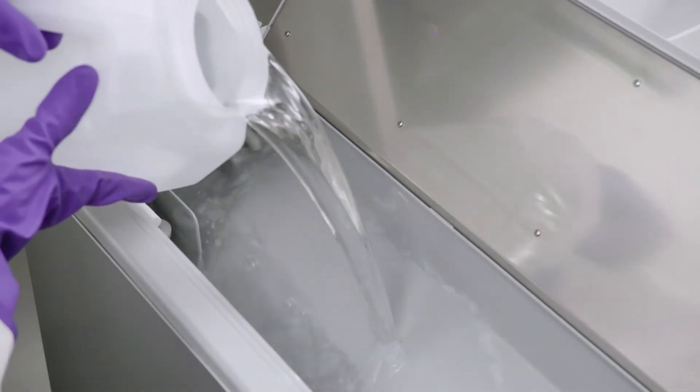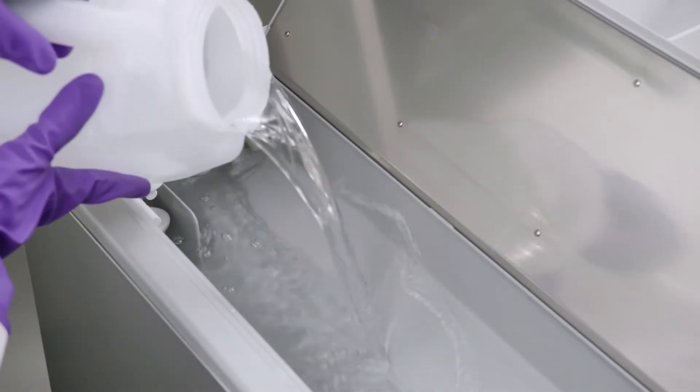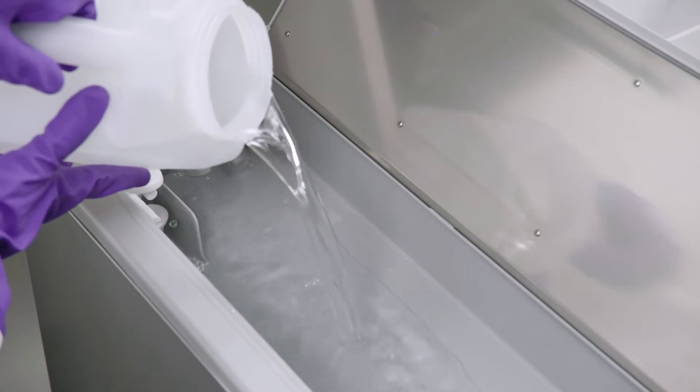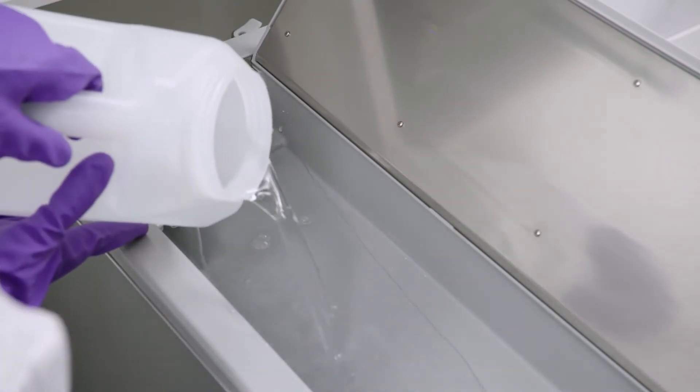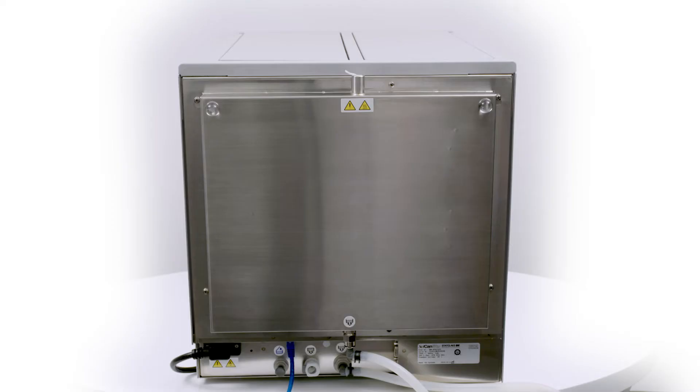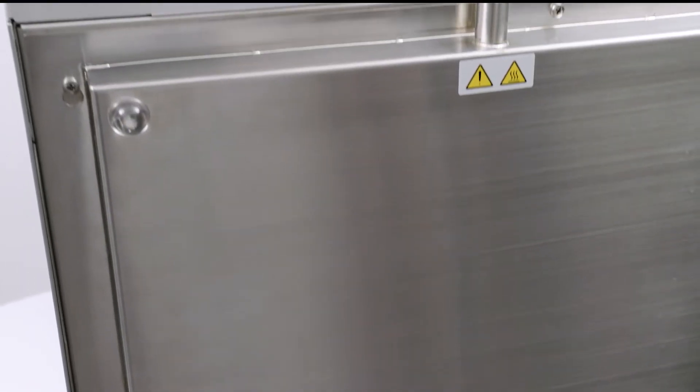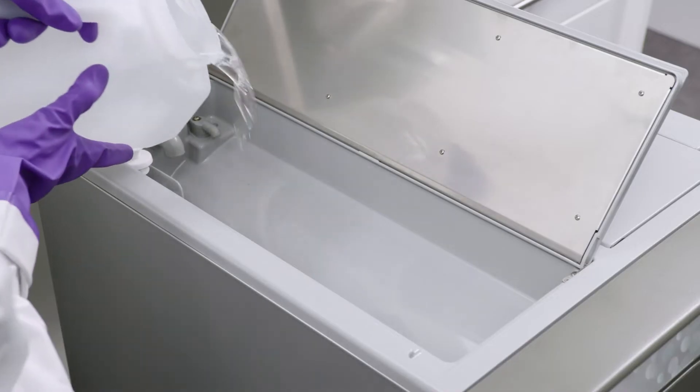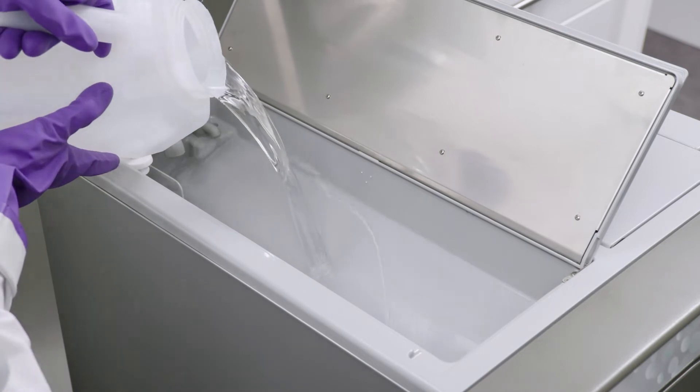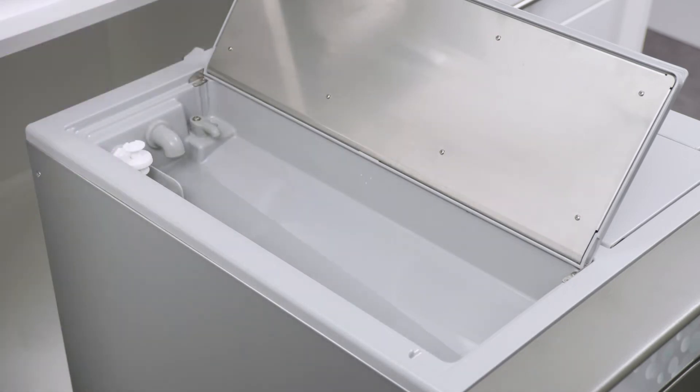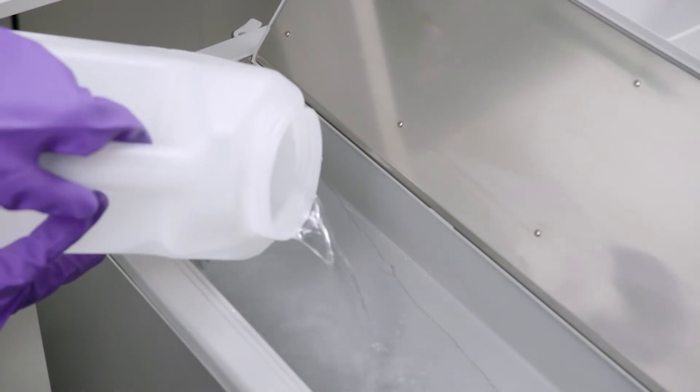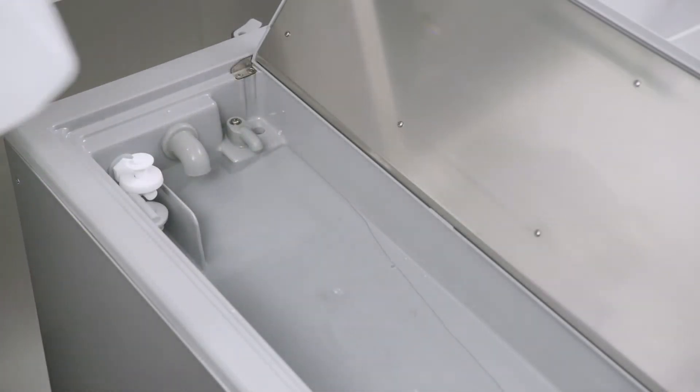To fill the Venturi Reservoir, open the lid, located on the top left of the unit, and fill with steam distilled water to the maximum fill line. The Venturi Reservoir is integrated with the condenser at the back of the unit. Together, these will take a combined 6 liters of distilled water. Fill the Venturi Reservoir to the maximum fill line and wait as the water flows from this reservoir to fill the condenser. Then top up the Venturi Reservoir to the maximum fill line again.